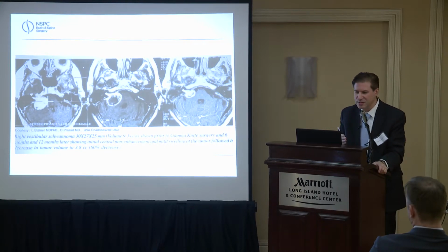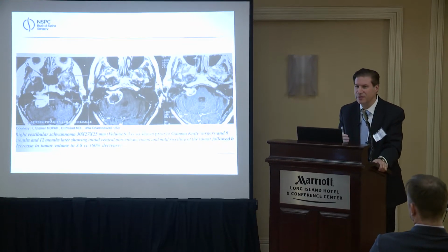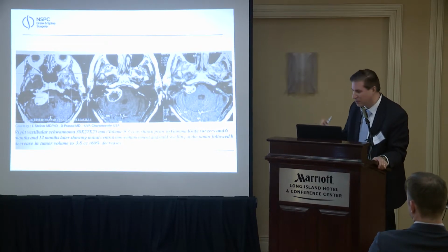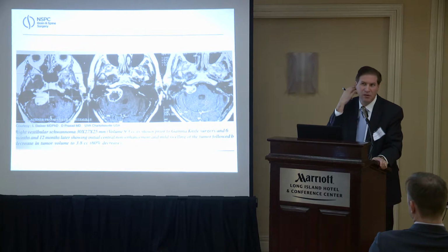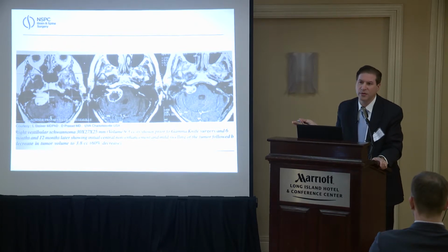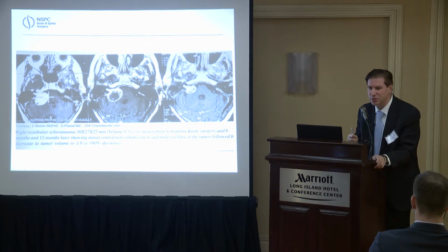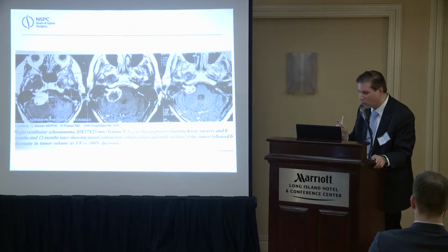And I'll tell you also, there's a lot of bad things that happen from surgery that aren't even included in the statistics. I'll see someone who has a suboccipital craniectomy, and then they have severe intractable pain in the back of the head that never goes away. And that won't even be included as a complication. That's like, oh, well, that's nothing. But surgery is a serious thing. These people do great with radiosurgery.